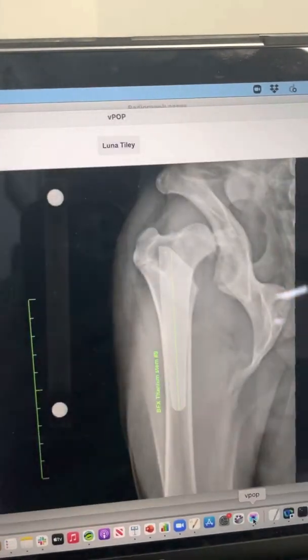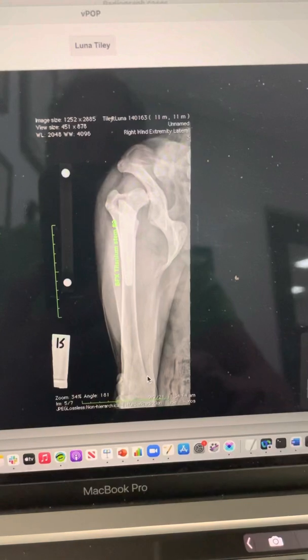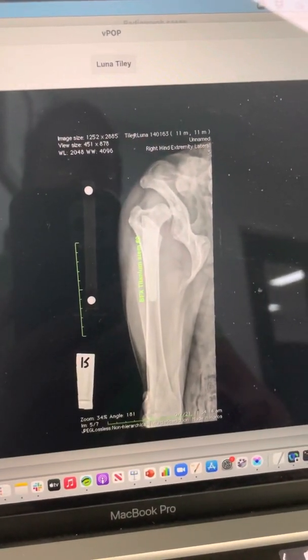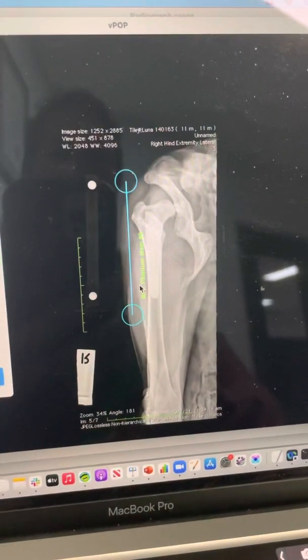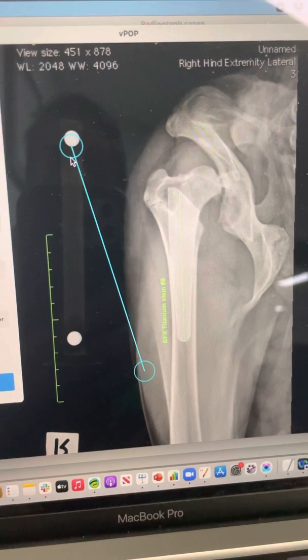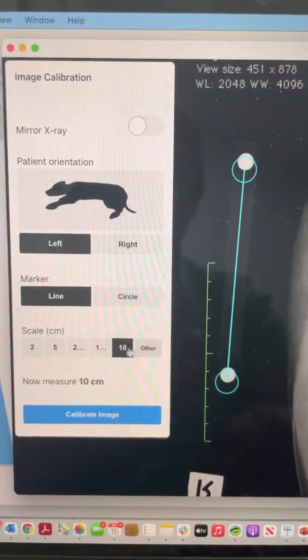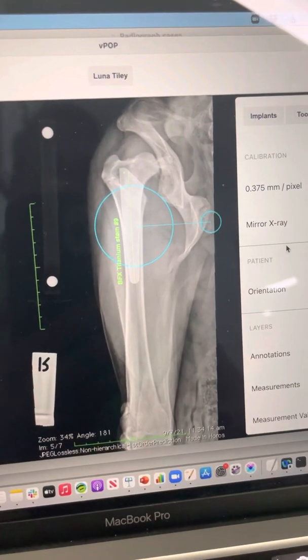What that looks like when we flip into our planning software is an x-ray like this — a nice straight image with the fabella bisected by the lateral and medial cortex, the patella sitting in the middle of the trochlea, and we can see the lesser trochanter and really nice morphology of the femur. The planning software I'm using is called VPOP Pro — it's a great planning software I use basically every day. When setting this up, we calibrate the image first. We have two balls in this image exactly 10 centimetres apart, and we use those to calibrate.